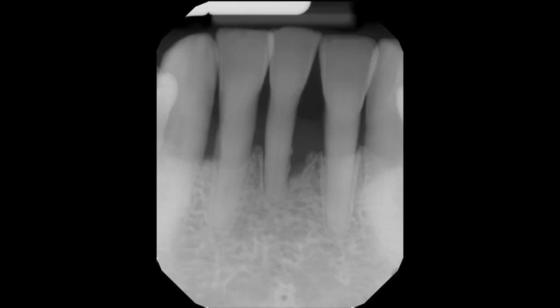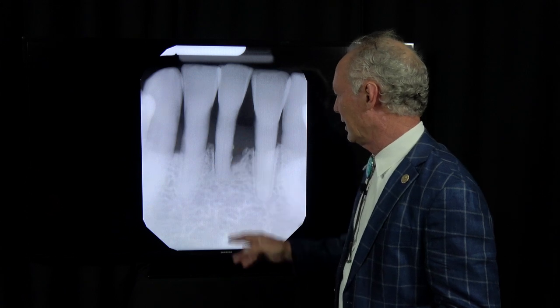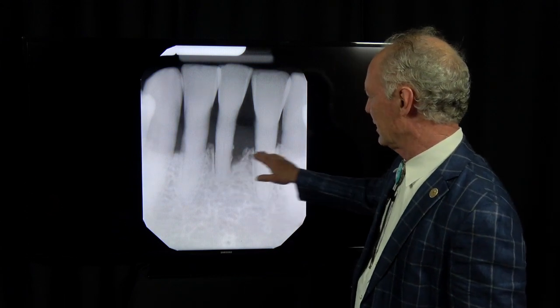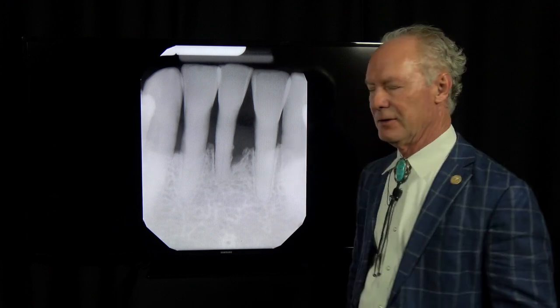This patient had mobile teeth — you can see — bone loss. In my opinion, most of the time if you take out one lower anterior tooth, you consider taking out all four of them. You can't put a conventional bridge on those teeth because the teeth are so small; if you prepare a millimeter and a half around each tooth, you end up with toothpicks or matchsticks.